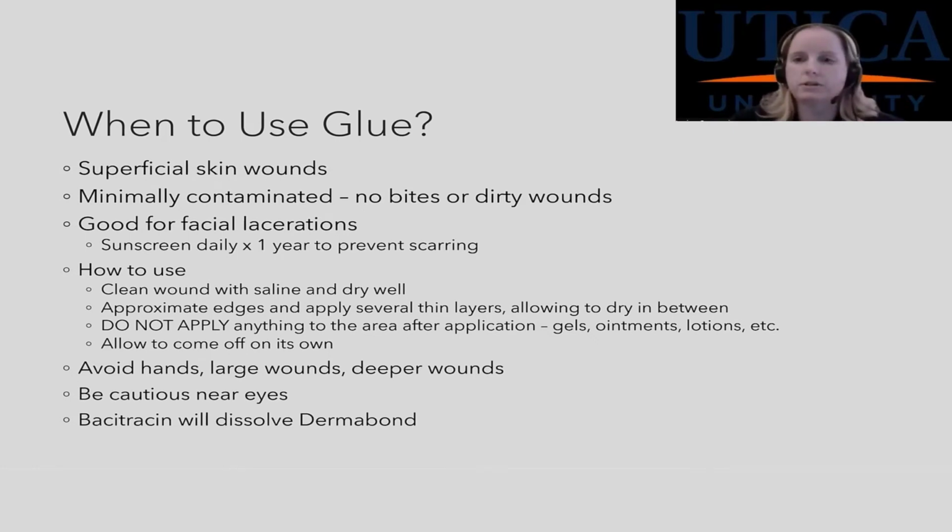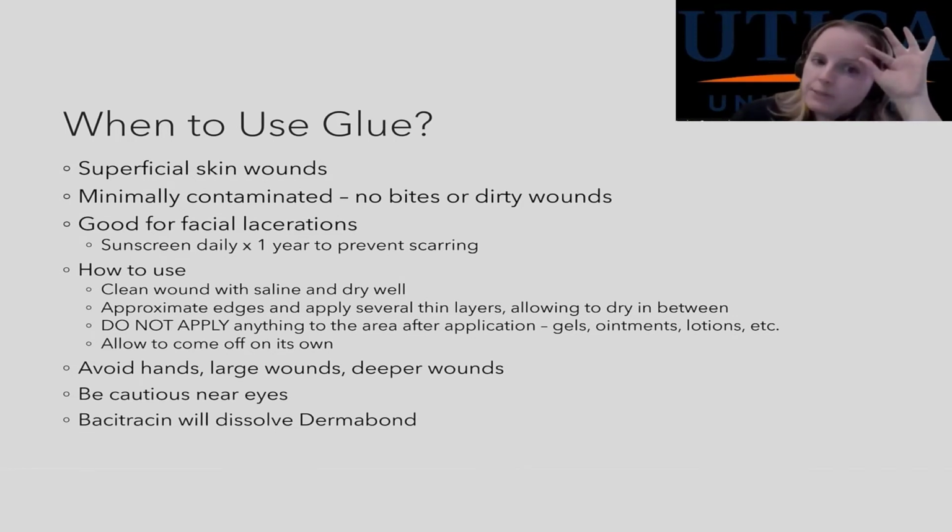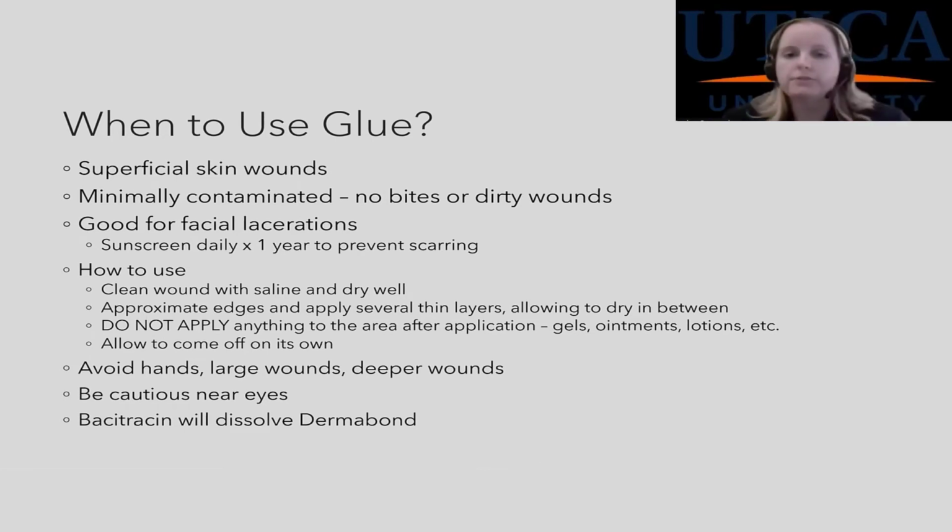They need to use sunscreen for a year. So how do you use it? You want to clean it with just some saline, dry it very well, approximate the edges. Okay. And then apply several thin layers and make sure it dries in between. And they should not apply anything to the area after the applications. Okay. So no gels, ointments, lotions, nothing, and allow it to come off on its own.